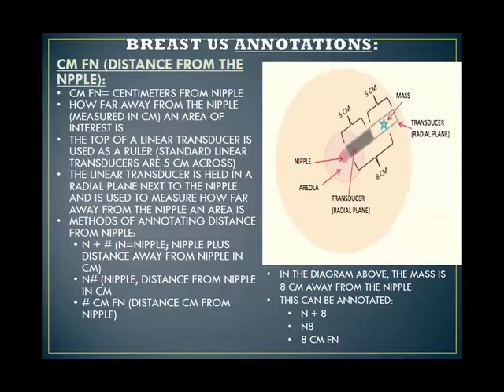Yep. Place your transducer right next to the nipple and you map out like a ruler, because we don't carry rulers in our pocket. And you just tell the patient, I'm mapping out where I am. Patients are like, okay.